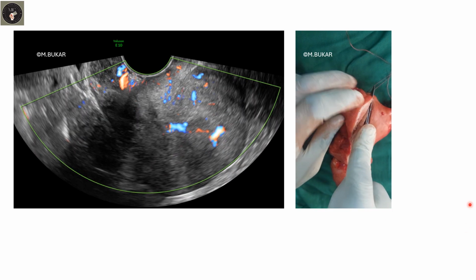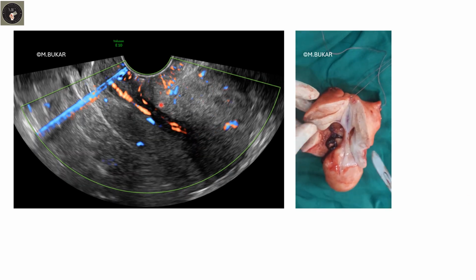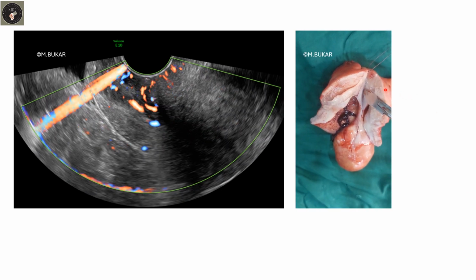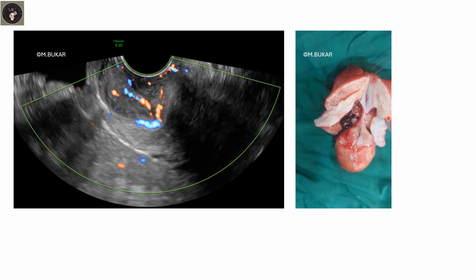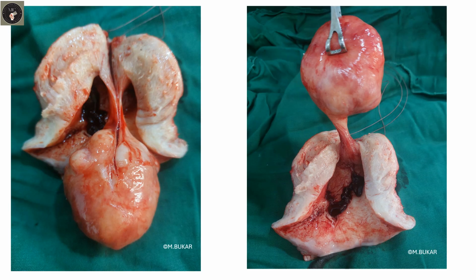Today, there should be no surprises at surgery. What you see on ultrasound scan should be what you see during surgery. So look at this, the origin clearly defined using Doppler, and it changed the management modality for this patient. Thank you very much for listening.